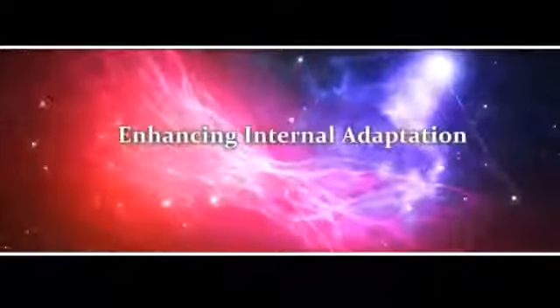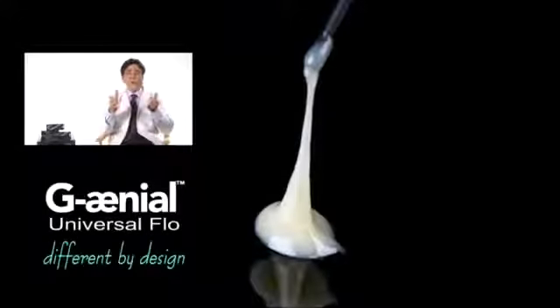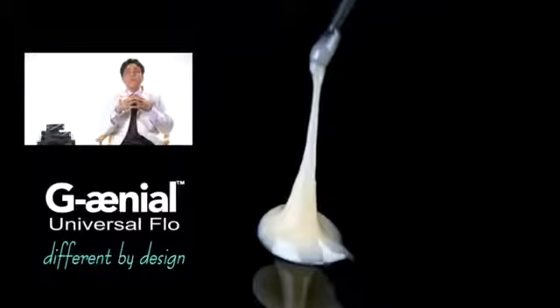To enhance internal adaptation, these next-generation flowable composites, such as Genial Universal Flow, are 69% filler by weight with an average particle size of 200 nanometers.